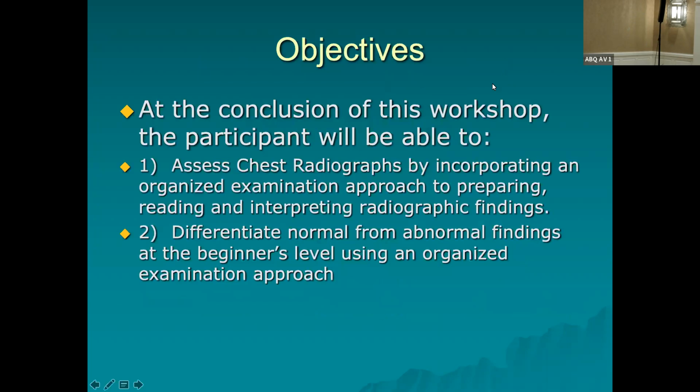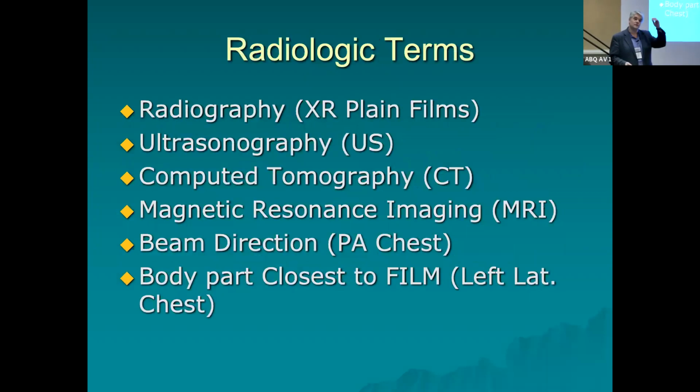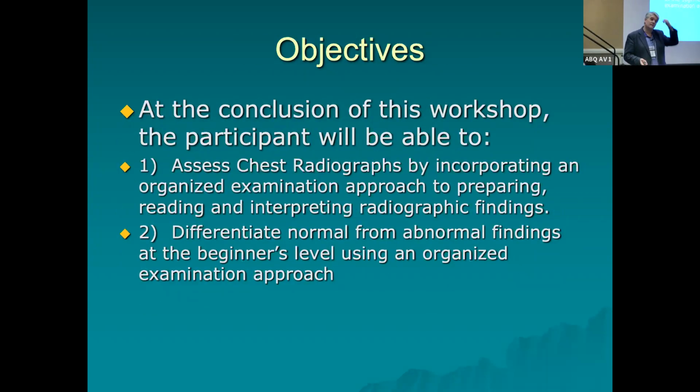Okay, so basically in today's workshop, we'll try to get an organized approach to how we look at x-rays, how we get a baseline approach to it, and then we'll try to learn how to differentiate normal from abnormal. Those of you who know me from my previous sessions know that the only dumb question is the one that's never asked. So please don't hesitate to ask a question. Sometimes I may say, great question, give me 2 or 3 more slides, and I'll try to advance it that way.